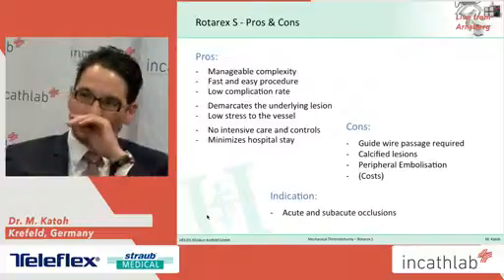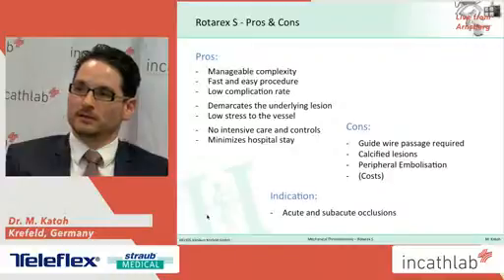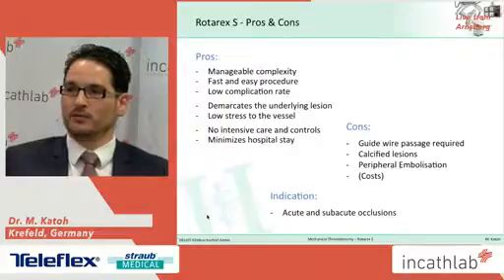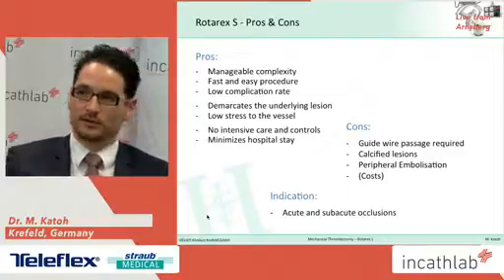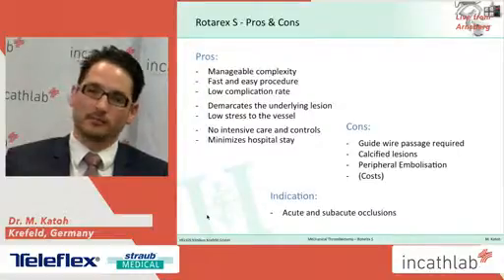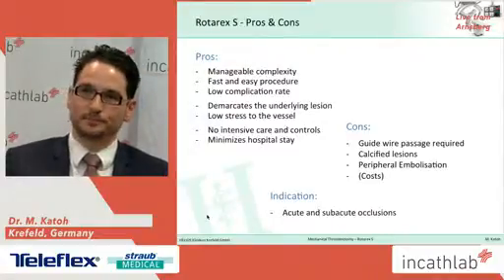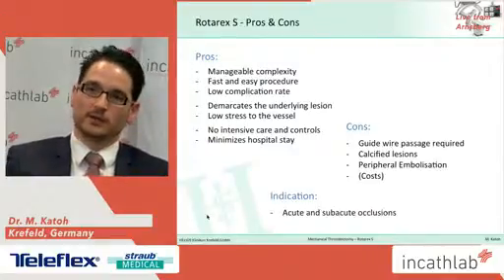On the contrary, like almost every other debulking device, the passage of the guide wire is a prerequisite or precondition, and one has to be careful in calcified lesions, since if a calcified lesion is sucked into the catheter, it might lead to a vessel perforation. Peripheral embolization is a complication which can happen, but in our experience it can easily be handled by a simple aspiration.